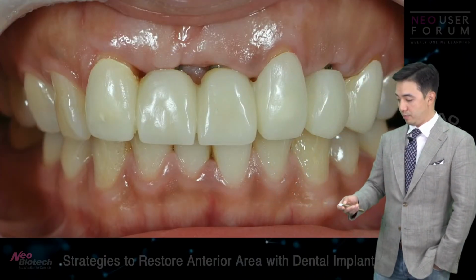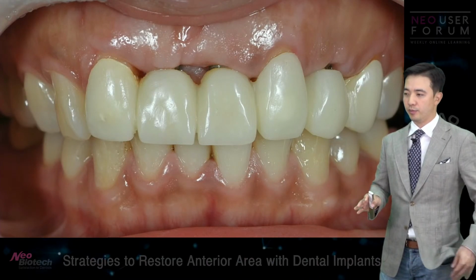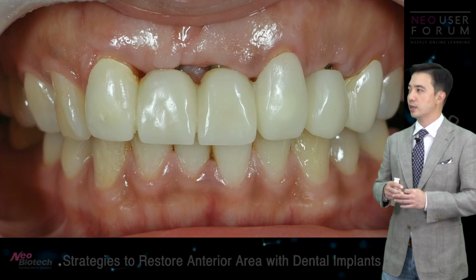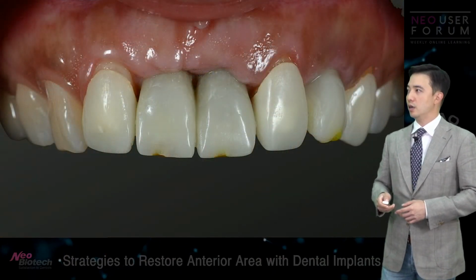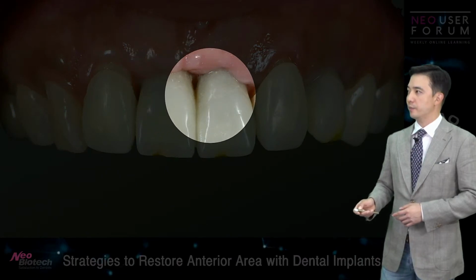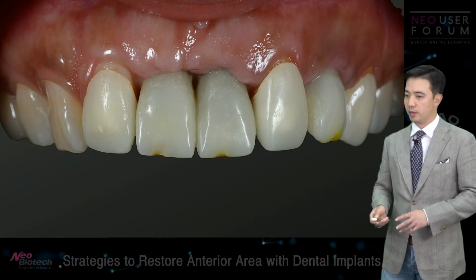Yeah, so these two were pontics during the waiting period before the number 11 and 21 got osseointegrated, and then after I thought those two were osseointegrated, I switched these two pontic areas, so I connected directly to the implant, right? So these two are screw retained provisional restorations on implants.